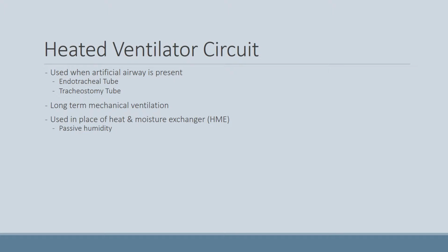This is our passive humidifier, and Mosby's Respiratory Care Equipment explains passive and active humidifiers. This HME acts as an artificial nose and captures exhaled heat and moisture and uses it to heat and humidify the next inspiration. But with this example, we'll be using an active humidifier, which provides heated humidity with sterile water and temperature control. Some other common passover humidifiers listed in Mosby's Respiratory Care Equipment literature are simple reservoir models, wick units, and membrane devices.